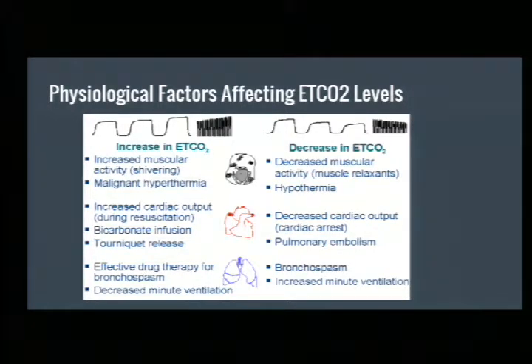If you give bicarb, or if you release a large tourniquet. So not an IV start tourniquet, but one you put on their thigh for a big arterial bleed, and that gets released while they're intubated. During that release, due to the cellular metabolism, all that lactic acid, and that whole cellular process, you'll see a transient increase in your end tidal.